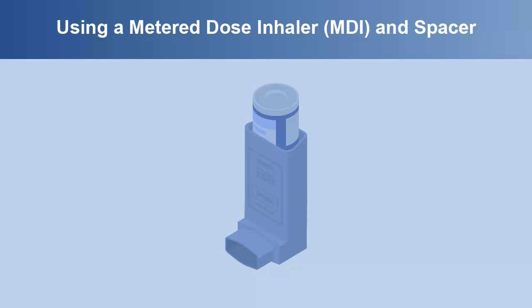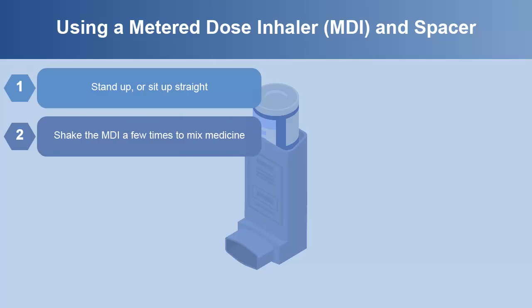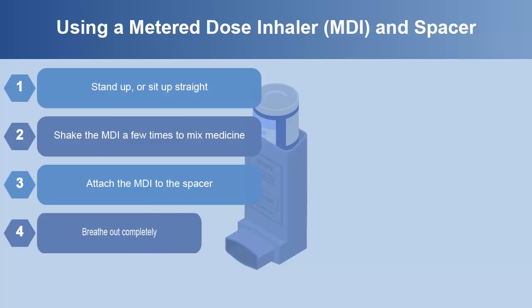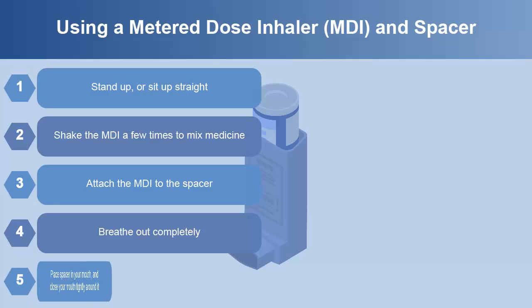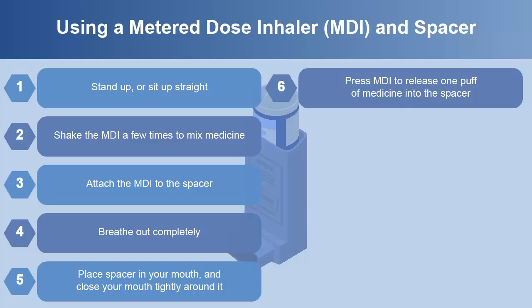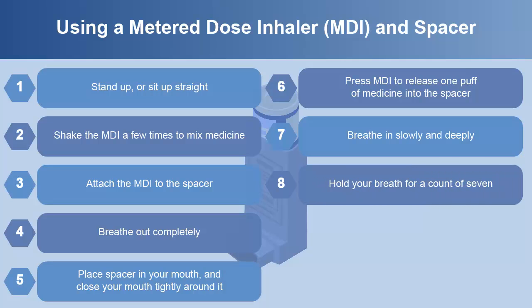To use a metered dose inhaler or MDI with a spacer, you should follow these instructions. Stand up or sit up straight. Shake the MDI a few times to mix the medicine. Attach the MDI to the spacer. Breathe out completely. Place the spacer in your mouth and close your mouth tightly around it. Press the MDI to release one puff of medicine into the spacer. Breathe in slowly and deeply. Hold your breath for a count of seven.